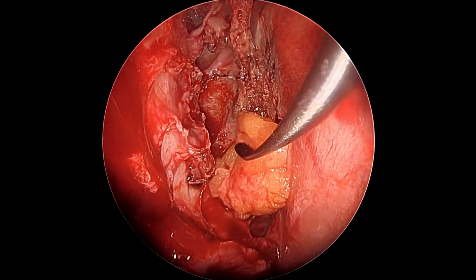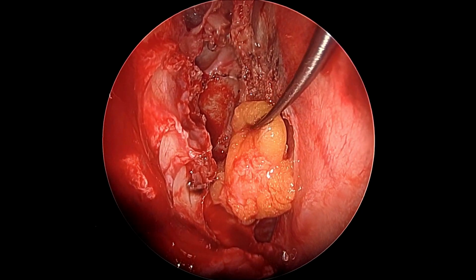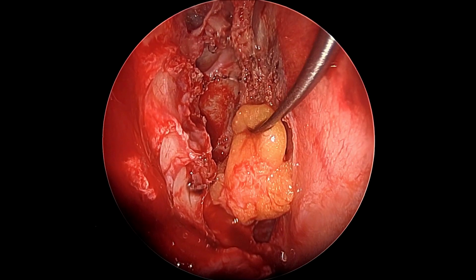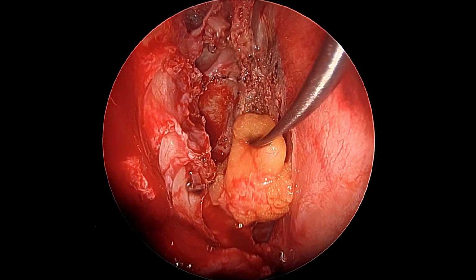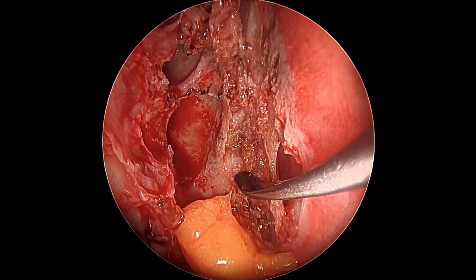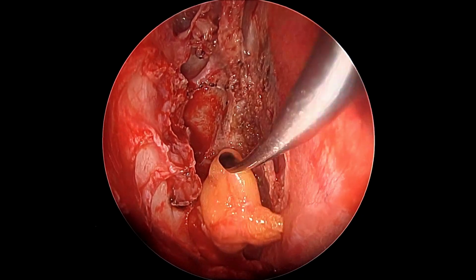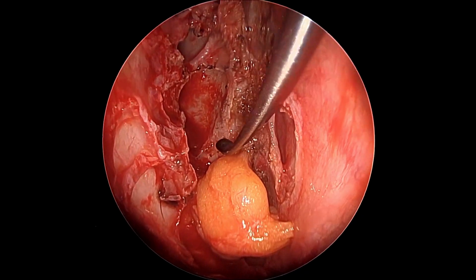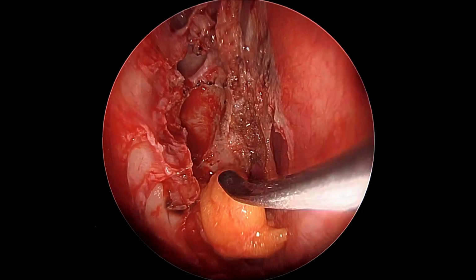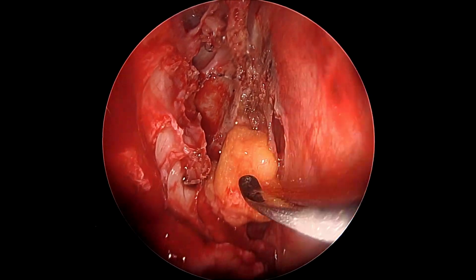We can see that there is no conflict of the instruments inside the nasal cavity, and we are able to work rather elegantly with this kind of an angulation. So once again, the fat must be appropriately sized. Very big fat portions cannot be inserted inside this cavity, and also we must not push it very hard.